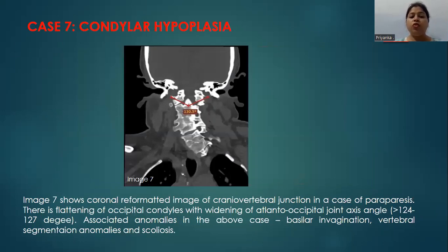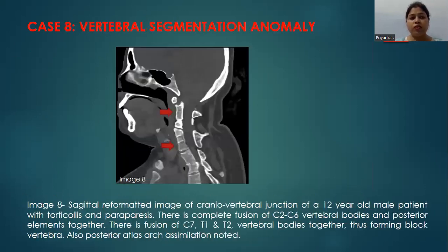This image shows coronal reformatted images of the craniovertebral junction in a case of paraparesis. There is flattening of the occipital condyle with widening of the atlantooccipital joint axis angle — in our case, 130.5 degrees. This is associated with other anomalies as well: basilar invagination, vertebral segmentation anomaly, and scoliosis.